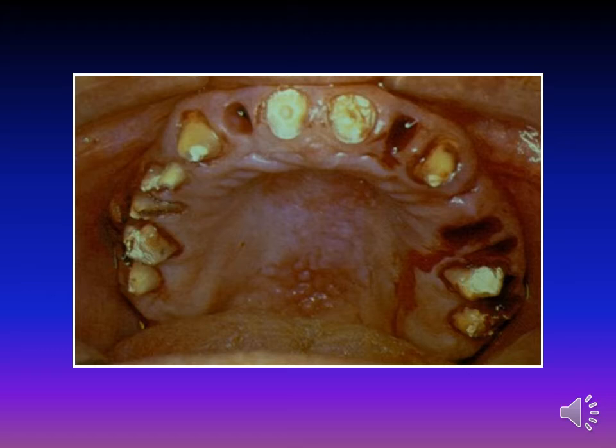patient selection. As we said before on patient selection, there are uses of the overdenture concept in other areas, like congenital and acquired defects, such as cleft palate, microdontia, amelogenesis imperfecta, dentinogenesis imperfecta, partial anodontia, and traumatic loss of many teeth. It is important to use this treatment in these cases.